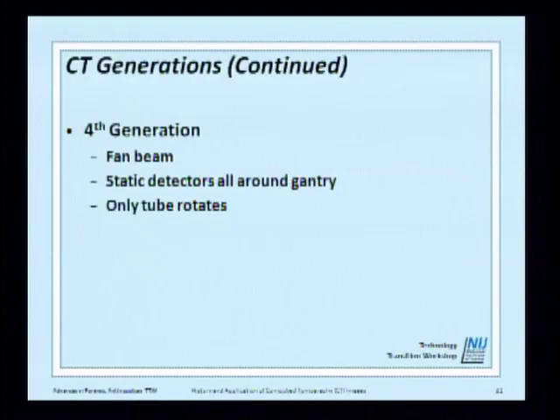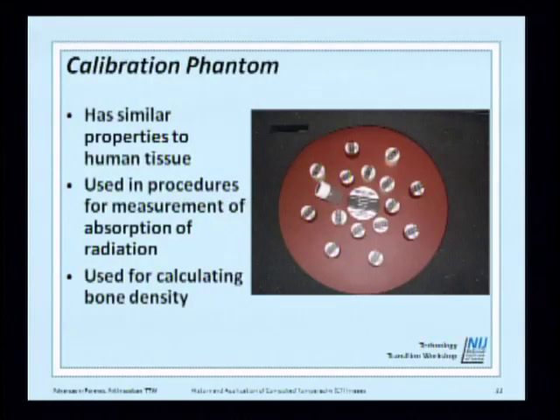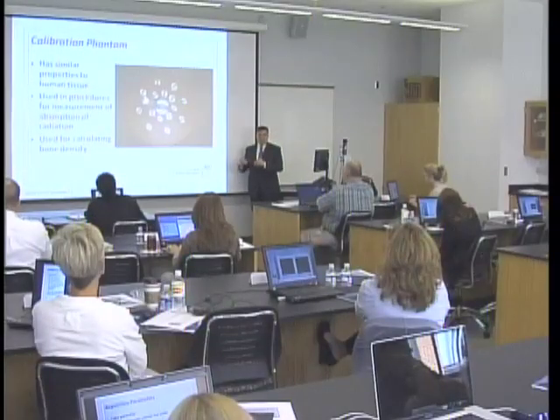Now, it's not included here. The fifth generation, we use cone beam, and that's the greatest now scanners. Now, how to solve the problem between different vendors or manufacturers? So we came with this idea a long time ago. I can't really keep track of all these parameters from machine to machine.